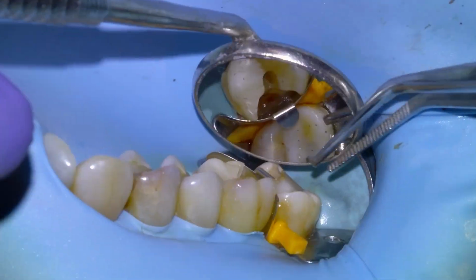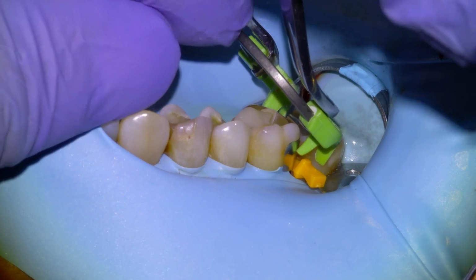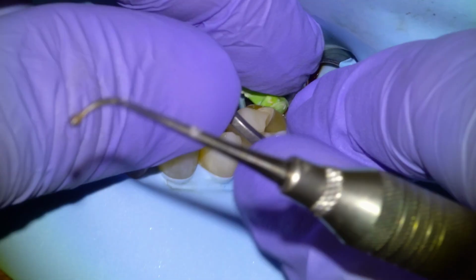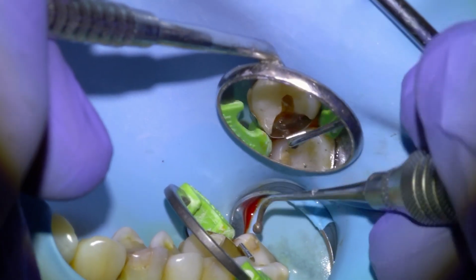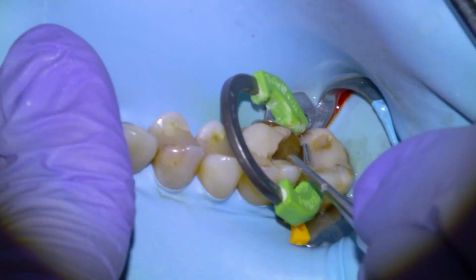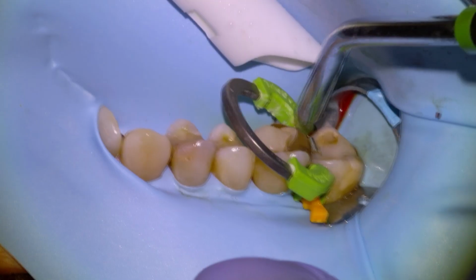So here we're happy with the band, and we're gonna seat our separator ring. And similarly, I like to seat these as apically as possible and then give them a good shake to really force the teeth apart so we end up with a tight contact. And then we're going to burnish our band against the neighboring tooth with a ball burnisher thoroughly. And then we're pretty much going to be ready to restore.